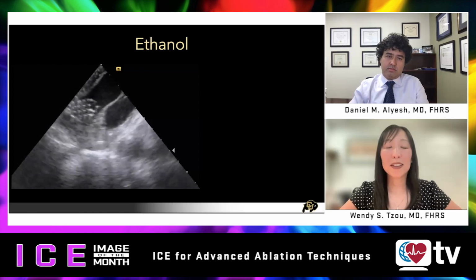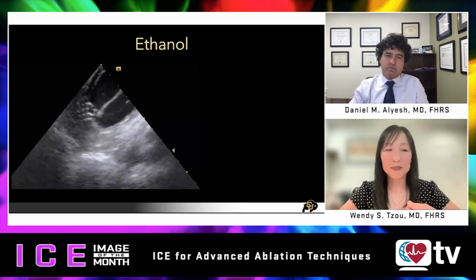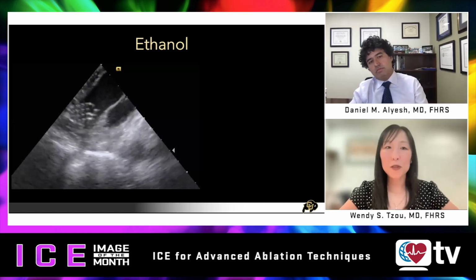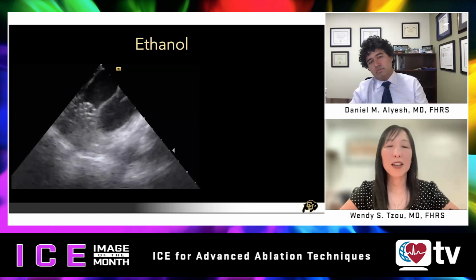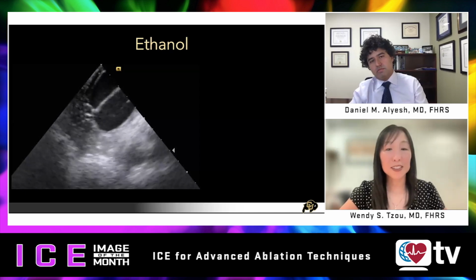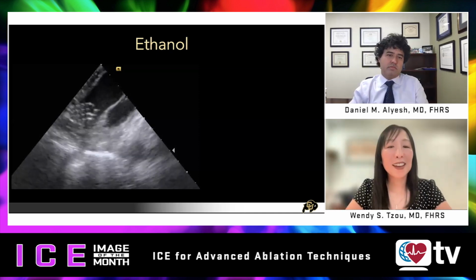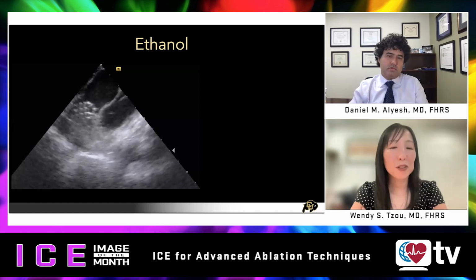And there have been incremental gains achieved with ablation of tough arrhythmias from the atria as well as the ventricles, in places where catheters can't reach, which really can't be understated. It's still an area of study, but I think it's an important advance. This is yet another LV Summit arrhythmia.